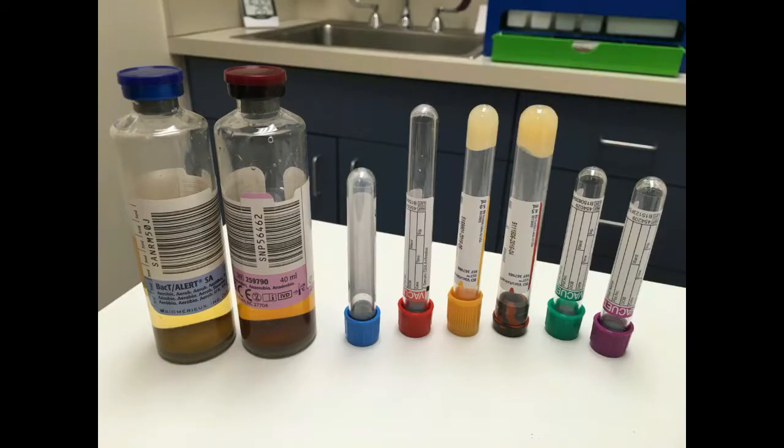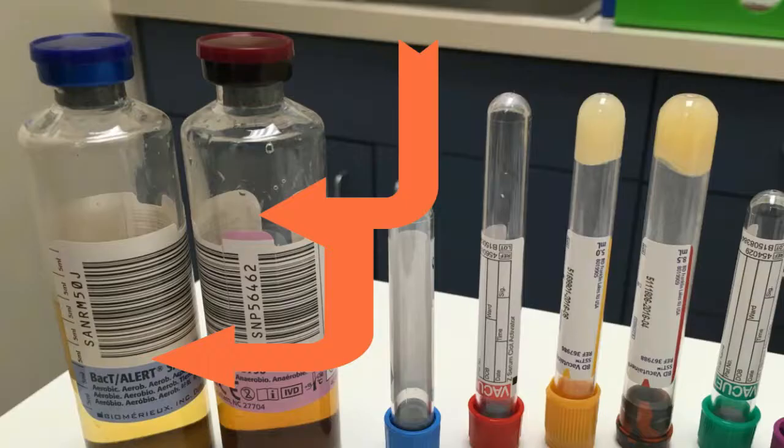While the area is drying, I will explain the order of draw from left to right. Blood cultures are ordered as a set of 2 bottles, aerobic and anaerobic. Aerobic requires the presence of oxygen, and anaerobic does not, for certain organisms to grow. These bottles are incubated up to 5 days. It is a test to culture bacteria or fungi that may lead to an infection in the blood.